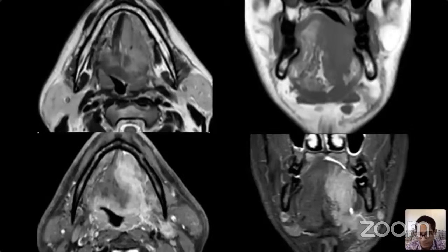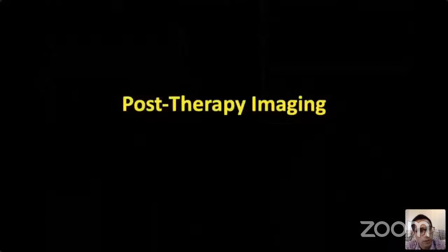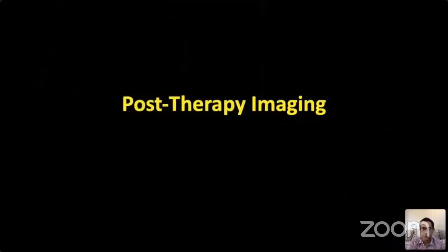an N3 node directly. Coming to the next case, this is a large volume disease eroding the mandible with pathological fracture of the mandible. There are necrotic nodes on both the sides, even at the submental level. The whole of the tongue bulk is involved, and posterior extension into the vallecula and the posterior pharyngeal wall with extensive large necrotic nodal mass at level 3. This is a gross disease. Patient is a palliative candidate, and he would only receive palliative therapy for the symptomatology.